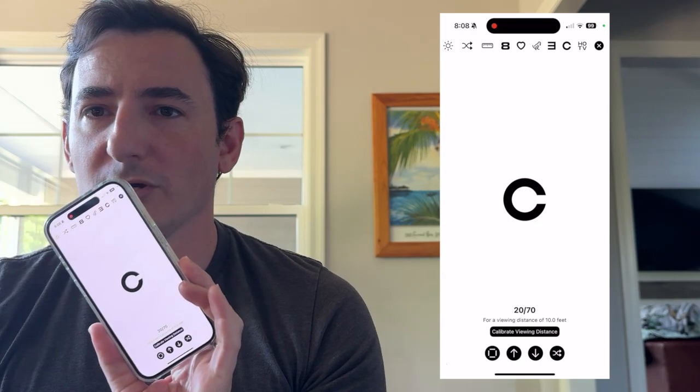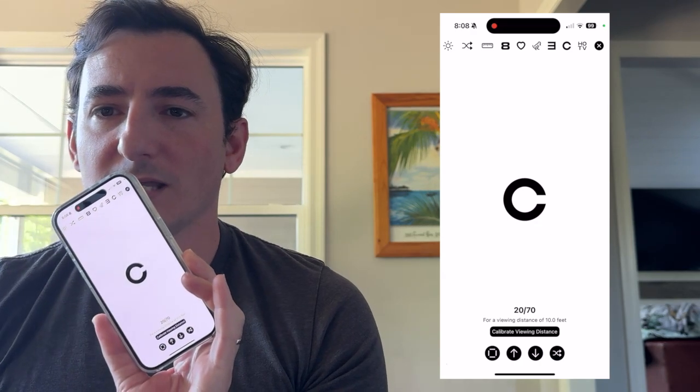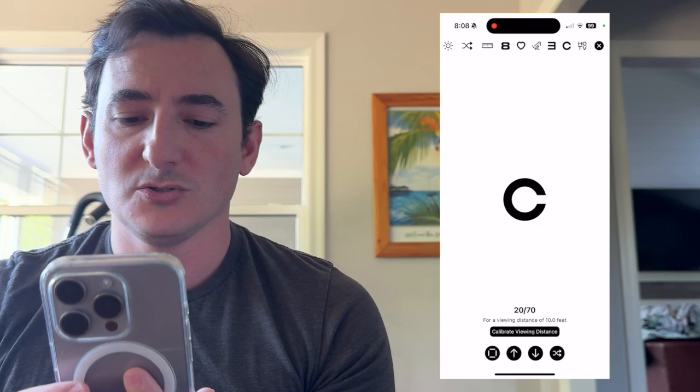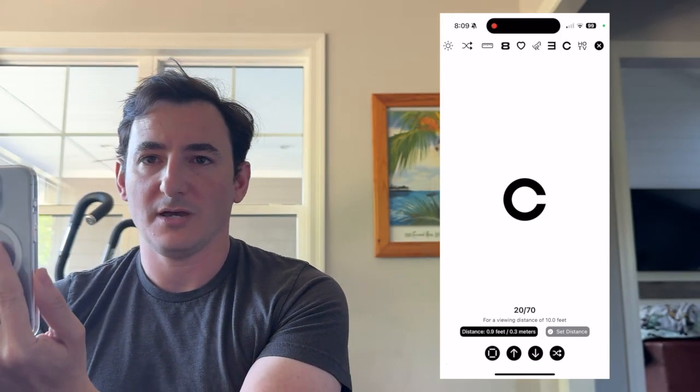The real highlight of this tool is the last button that says 'calibrate viewing distance.' All you do is tap this button and place the phone adjacent to the patient's eyes or face, and you'll see it display the distance in meters and feet, updating in real time as you slowly move the phone away.